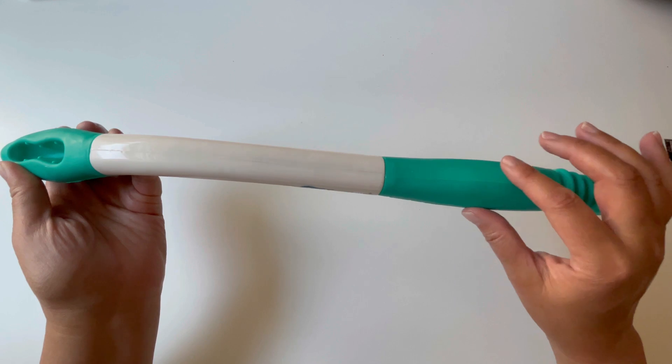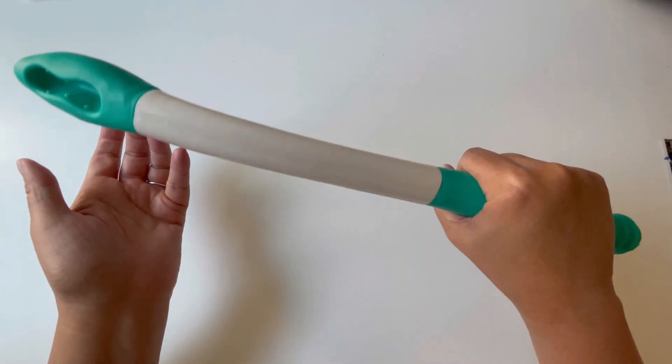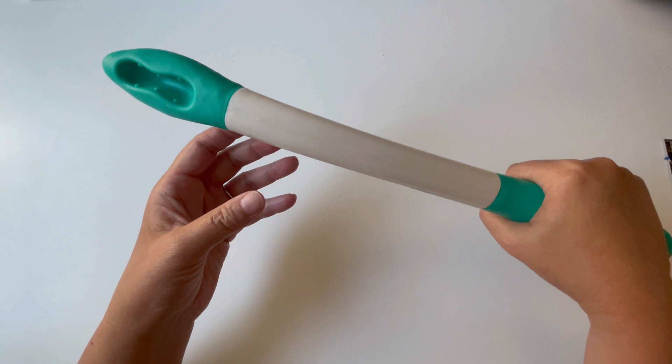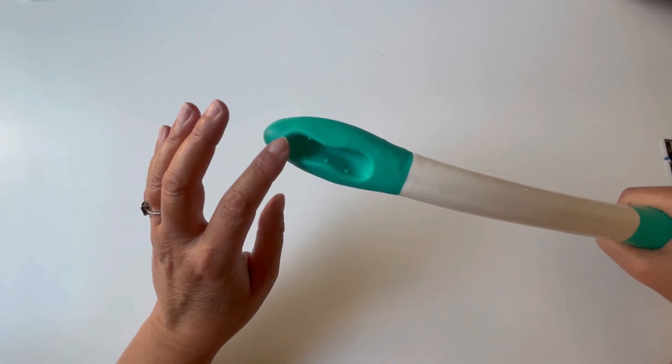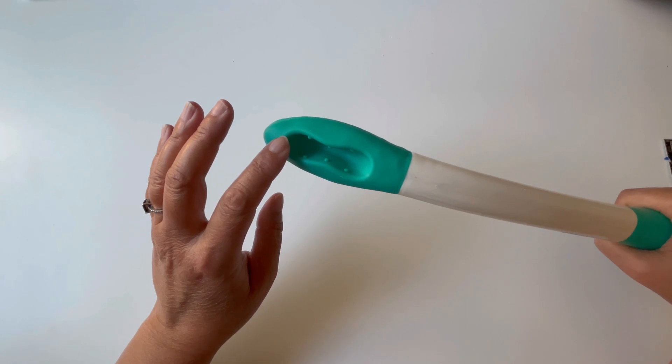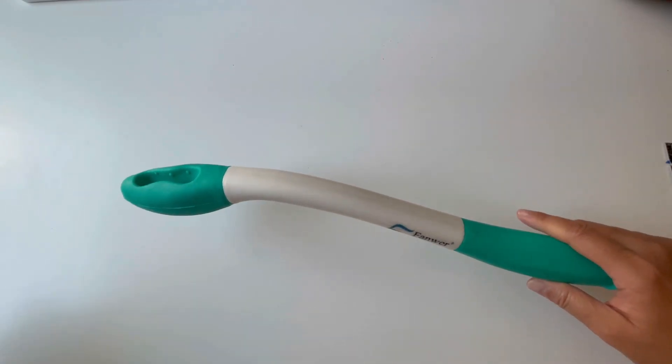The tacky plastic will ensure that you have a firm grip and it grips the wipes or toilet paper securely. This is ergonomically designed so that you can reach your sitting areas.